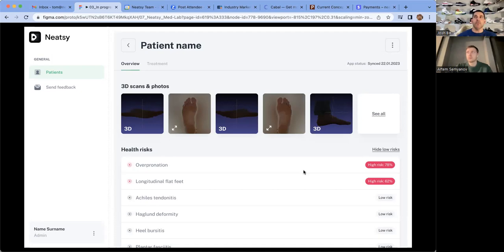It's not going to take the place of you seeing patients in person, but I think especially with asynchronous connecting with patients, some maladies can be diagnosed, we think, through this portal using the 3D images.